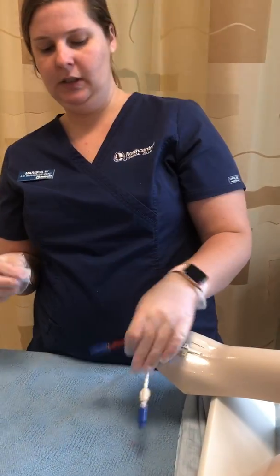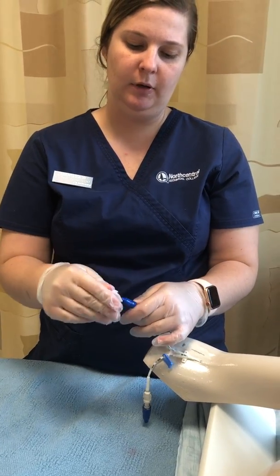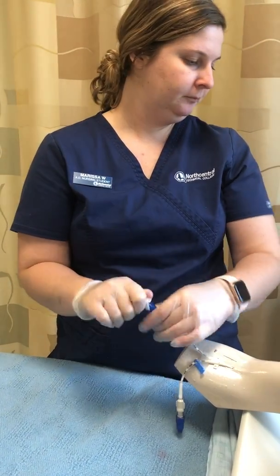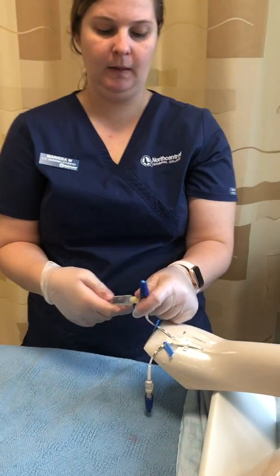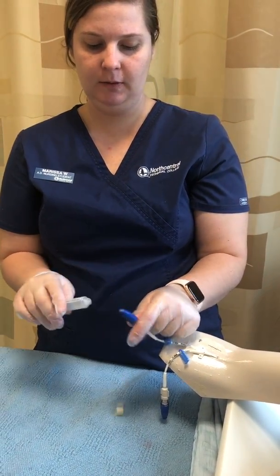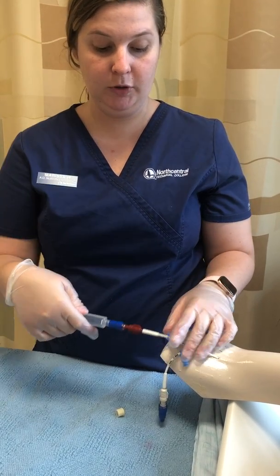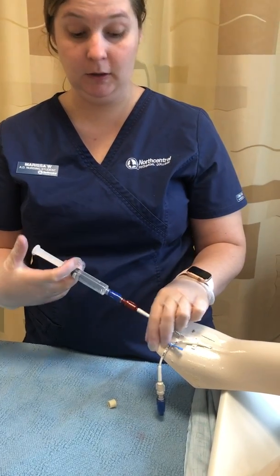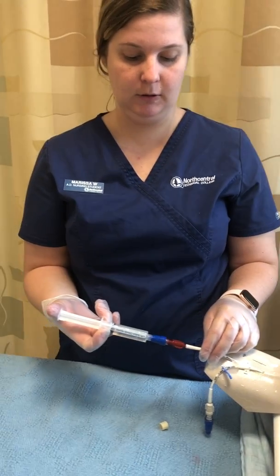So then I'm going to use my alcohol swab here. And when I'm cleaning that end here, I'm going to be doing it based on agency policy, however long they say that is. For this case, I'm just going to do 15 to 30 seconds. Alright, once 15 to 30 seconds is over, I'm going to take my first flush here and connect it. I'm going to unlock or unclamp my PICC line and I'm going to slowly flush.